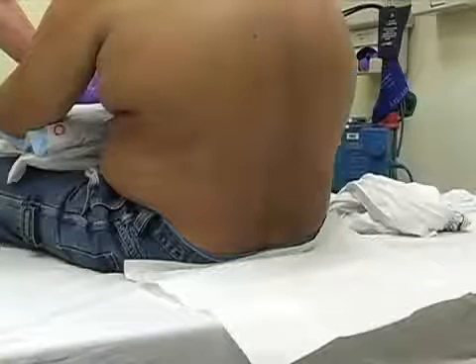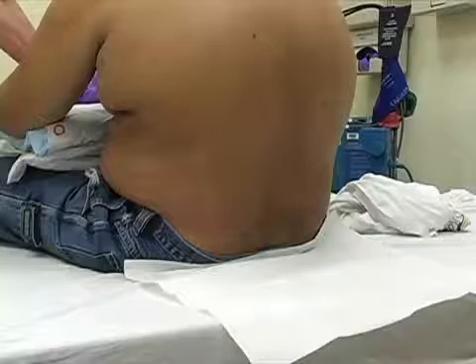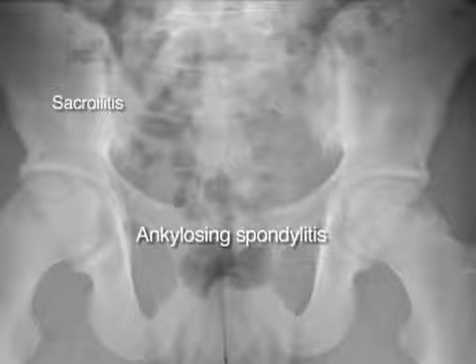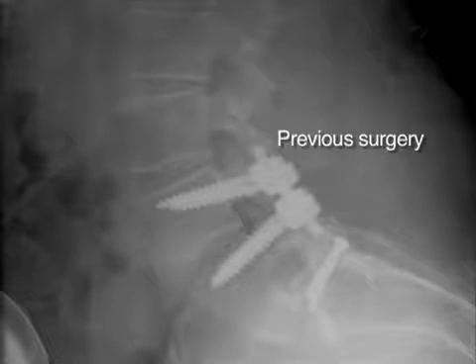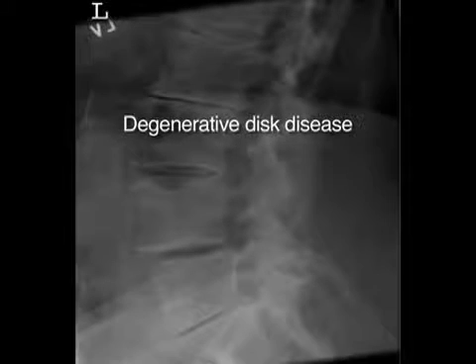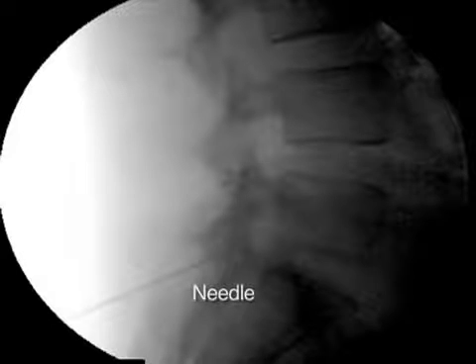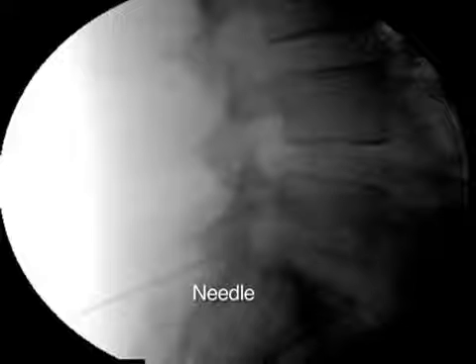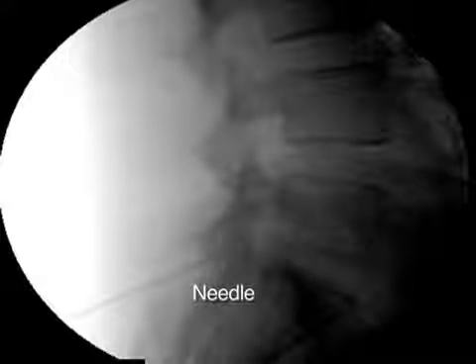Obese patients may represent a challenge due to difficulty in identifying landmarks. Other conditions such as osteoarthritis, ankylosing spondylitis, kyphoscoliosis, previous surgery that has altered landmarks or spaces, and degenerative disc disease also may make the procedure more difficult. If faced with these challenges, consider consultation with an anesthesiologist, or perhaps a radiologist, if fluoroscopy-guided lumbar puncture seems to be a better approach.